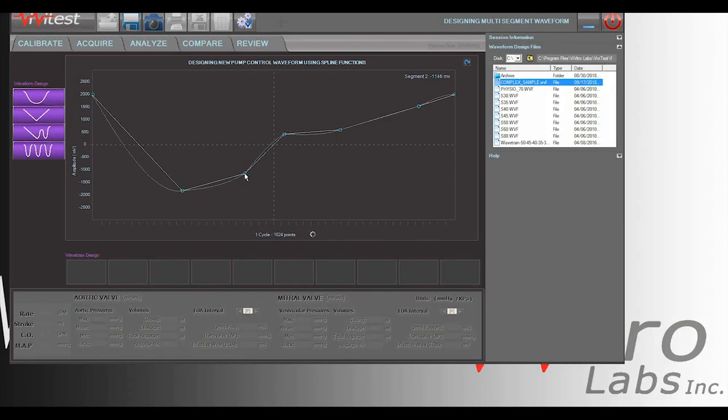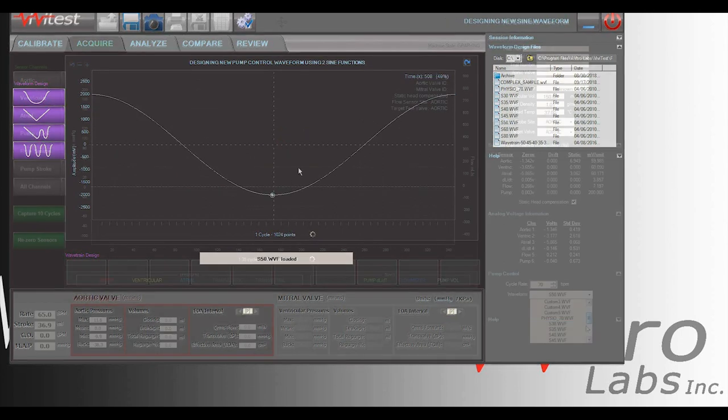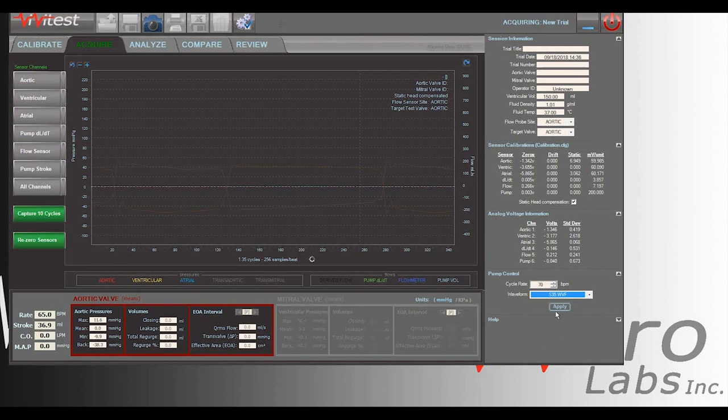Vivitest software offers the advantages that unlimited waveforms can be selected and the beat rate for each waveform can be changed quickly.